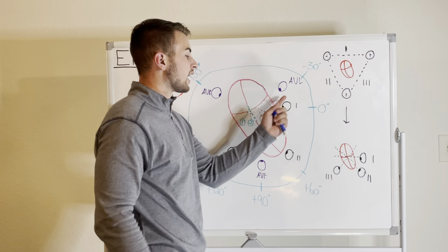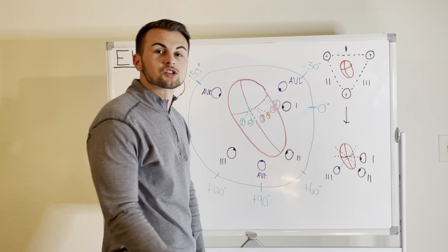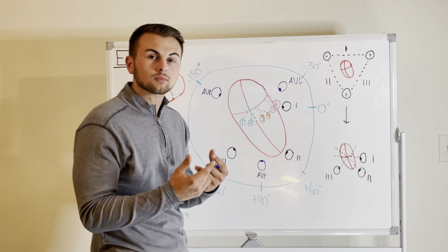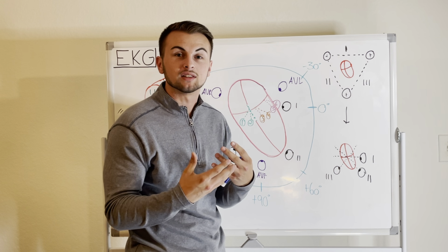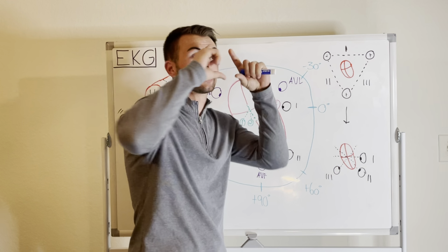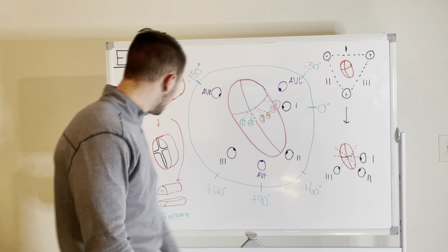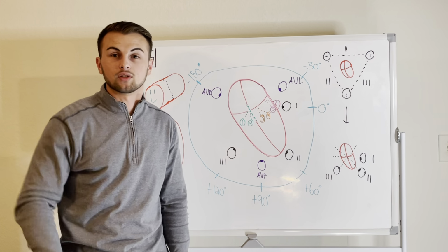Now, the EKG system also does some calculations based on these three leads to give us aVR, aVL, and aVF. These are called augmented limb leads, and they also act as little cameras or little eyeballs that are looking at the electrical activity of the heart from different angles. It is important that we know these angles at which the limb leads and augmented leads are located, because it will tell us the direction at which they are looking at the electrical activity of the heart. And remember, the positive lead cameras are looking at the coronal or the front view of the heart.